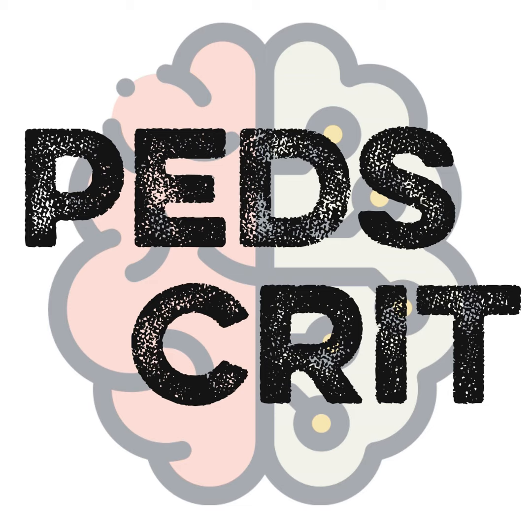When you say clamp, it's basically placing clamps on both cannulas. And then you have a shunt, or a bridge, that is left open so that there is still some flow going through the circuit. One thing that is frequently forgotten is to remove all the drips that are going through the ECMO cannula to a different side. Because if you're going to clamp, they're not going to see the drug. For example, if it's a sedation or something that is going through. So these are little things that we sometimes forget. Or your epi. And then, right. Yeah.